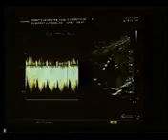That is the problem which nobody knows. If the PRF setting is so high, you can create absent diastolic flow in every patient. In any normal patient whose umbilical cord you show me, I can make the diastolic flow absent. This is the problem which very few people realize, even those who are doing it.